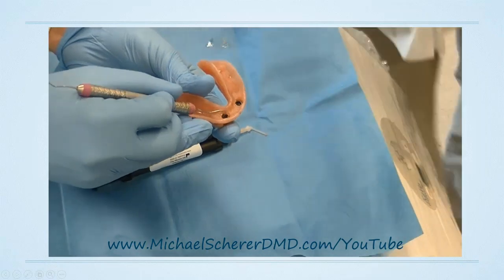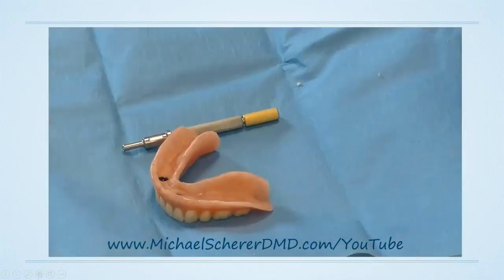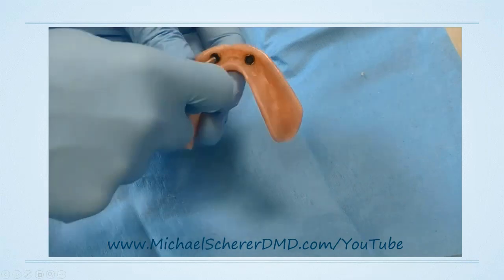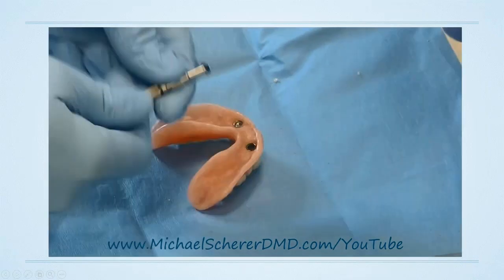The only time that you miss the pickup is if there's saliva or moisture contamination during the composite resin injecting into the denture, meaning that the patient goes, oh, what's this? And they push their tongue right on top of the locator abutment.